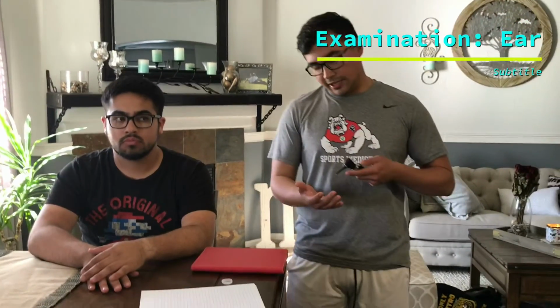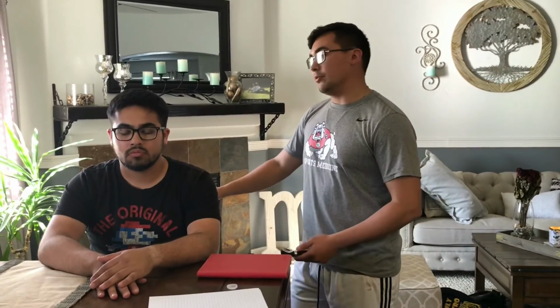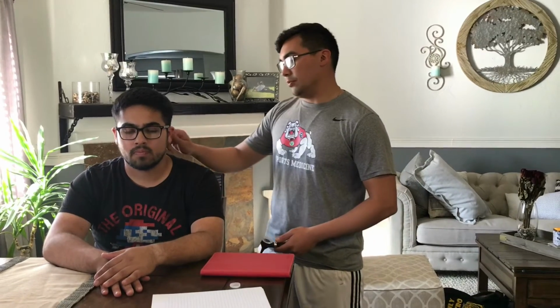All right, so I'm going to be doing an ear examination here of Michael. One of the first things I want to do is just check the light of the otoscope, and it looks like it works pretty well. The second thing I'm going to want to do is pull back Michael's ear, just so I can get a clear view of the tympanic membrane, his ear canal.